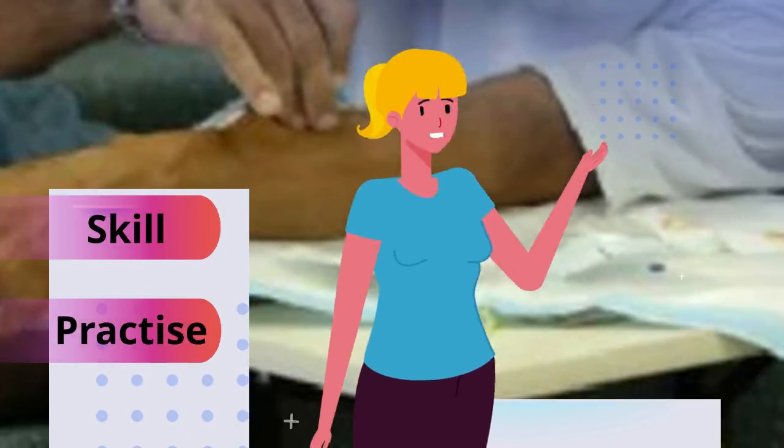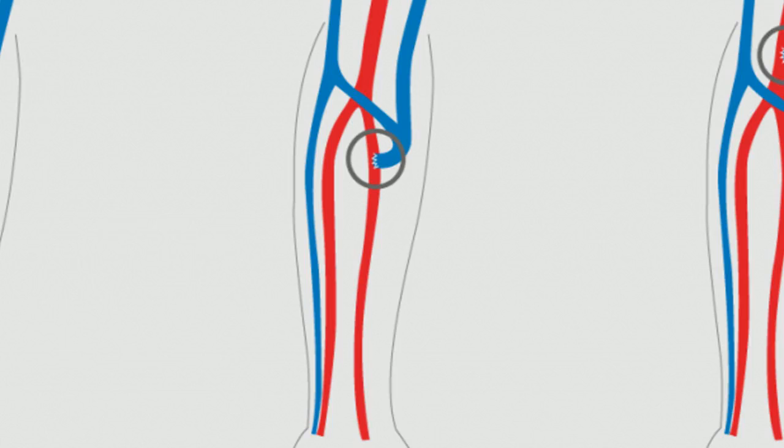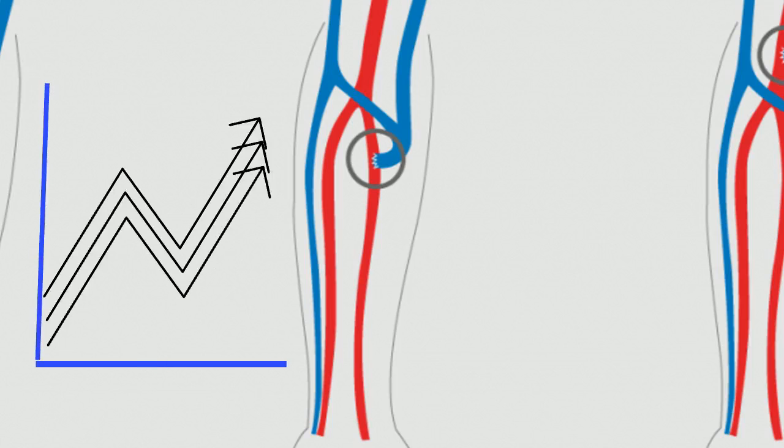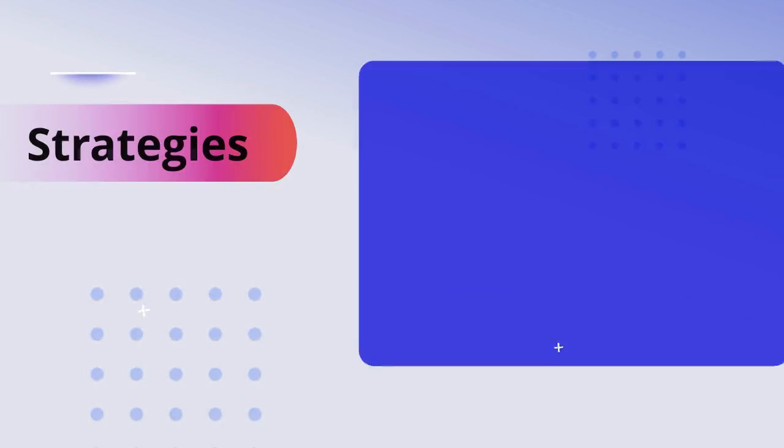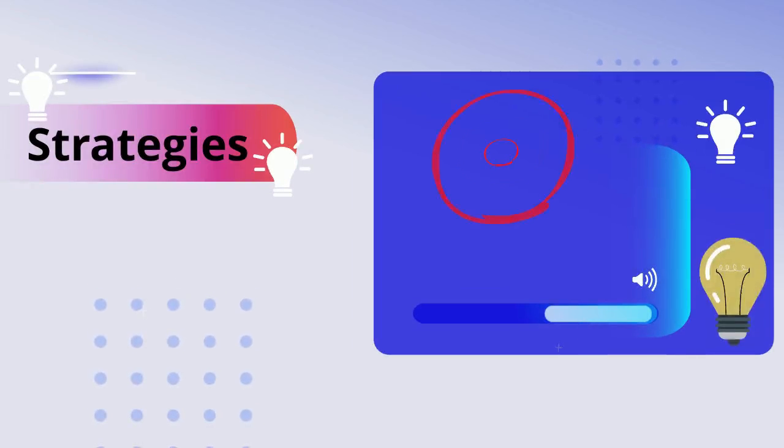Self-cannulation is a skill that takes time but can be mastered with practice. One person cannulating the access improves its longevity. Patients are the best at detecting an early sign of infiltration during self-cannulation. Let us now review some strategies to overcome fear of needles.